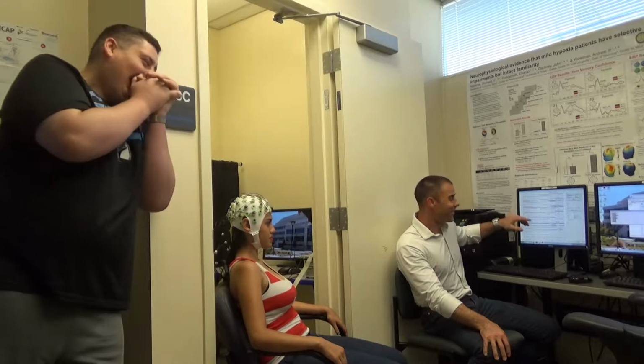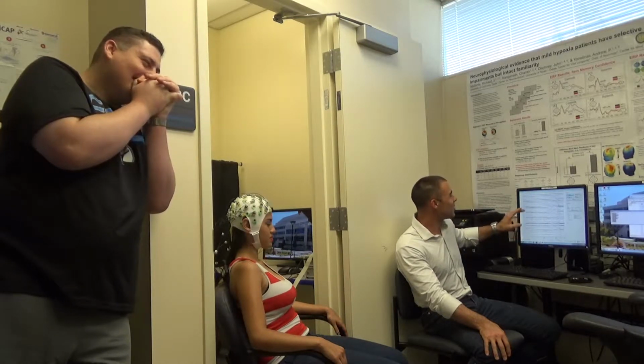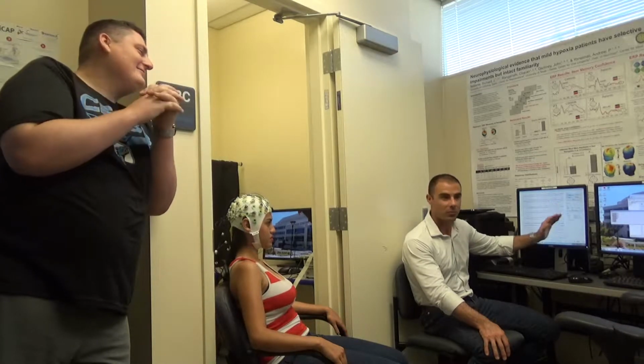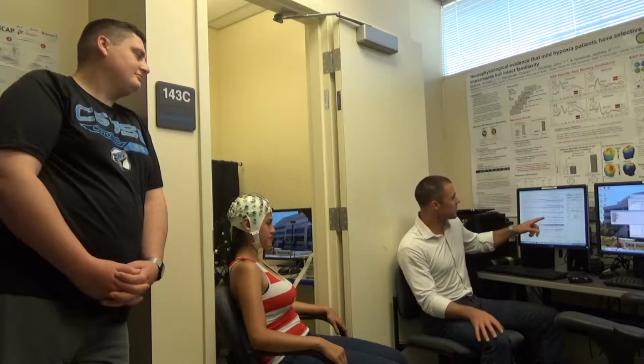Point being that we can see that the EEG has gotten a little bit more stabilized, right? So if your participant gets bored or they stop listening to you because they think they're in the chamber by themselves, and they start tapping their feet, or clicking their pen, we can start seeing all these artifacts that you guys already spent a lot of time cleaning up in the data.